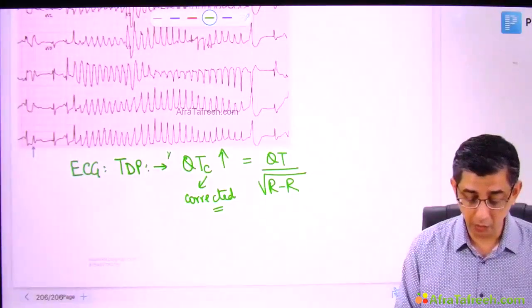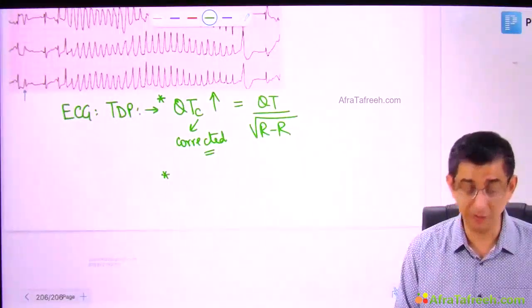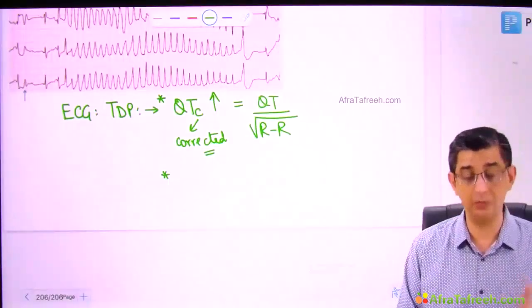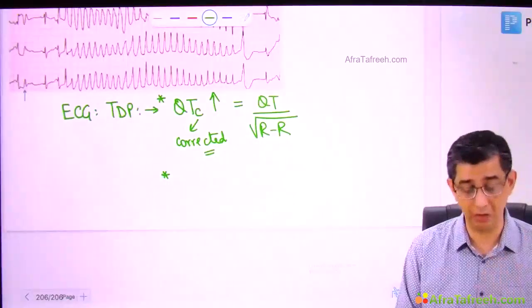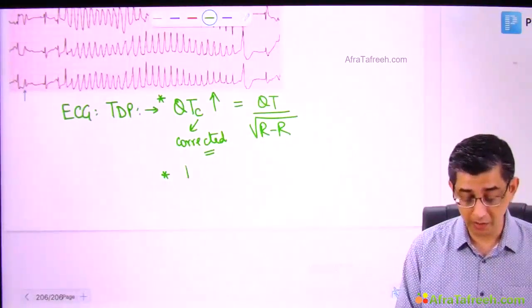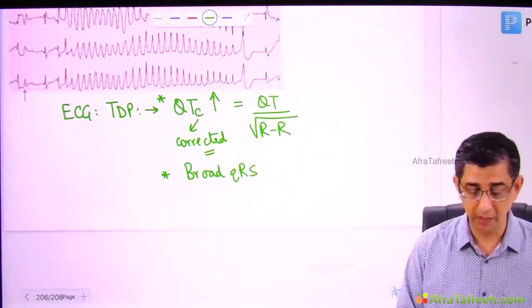Whenever you read about QTC prolongation, that's an important or easy way to crack this question of torsades de pointes, assuming that you are not able to remember the etiology of electrolyte imbalances or the drugs that I was talking about. Apart from this, the standard features will anyway be present and can be visualized on the slide at the moment. They would still be.